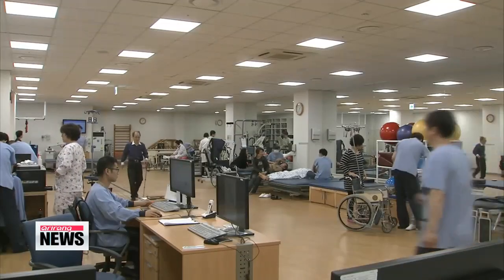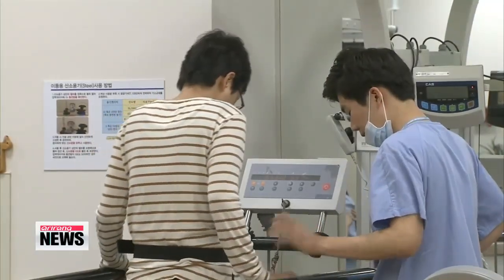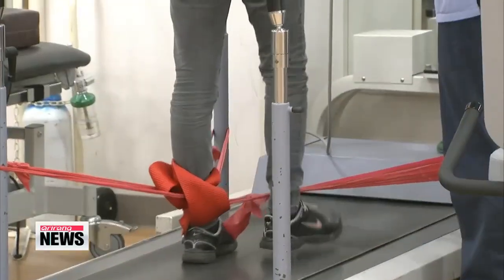With potential to help patients undergoing rehabilitation, the robot is slated for commercial development in a year. Park Se-young, Arirang News.